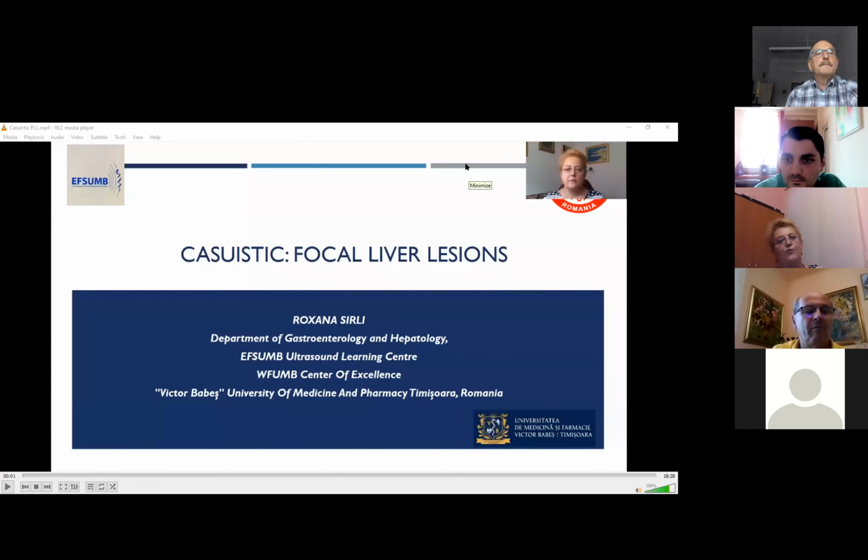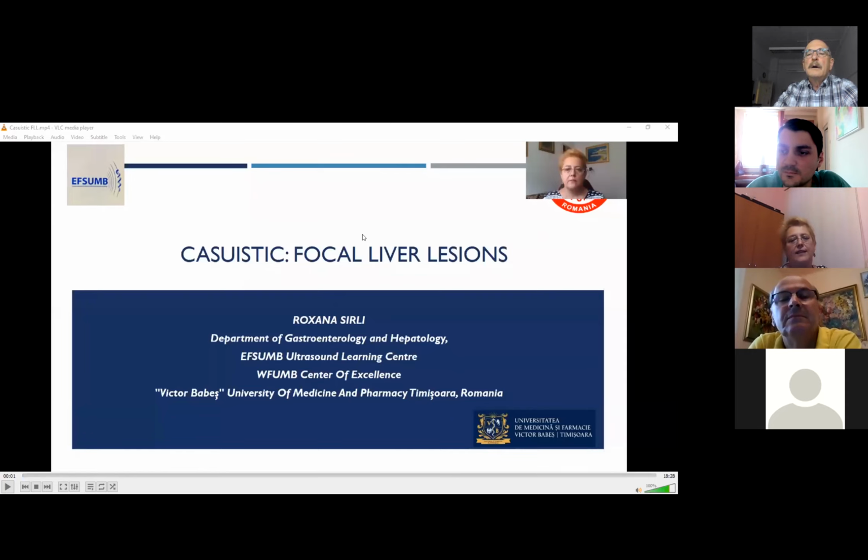Okay. There is one more question that I think is important, and maybe Professor Spora, you can answer. How do you compare the sensitivity and specificity of contrast-enhanced ultrasound with triphasic CT in the diagnosis of hepatocellular carcinoma? It's on the chat. You should unmute your microphone, Professor Spora. Which is the question, Roxana? How to compare the sensitivity and specificity of contrast-enhanced ultrasound with CT in the diagnosis of hepatocellular carcinoma?